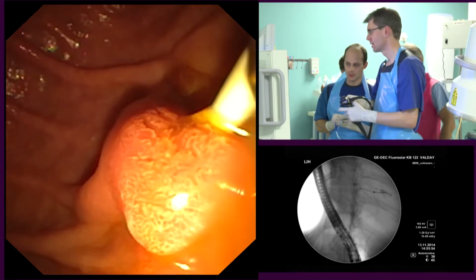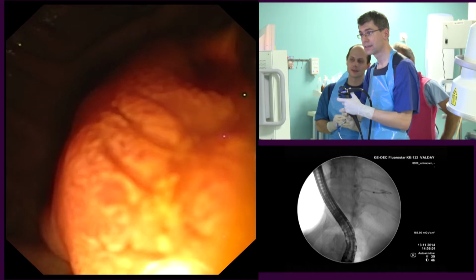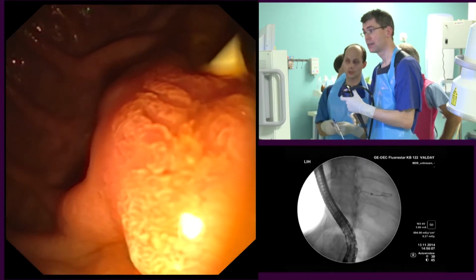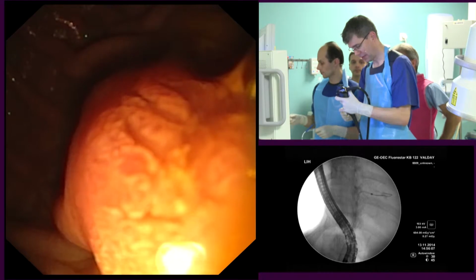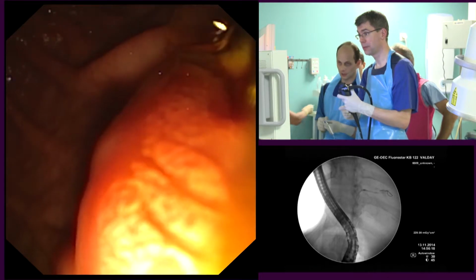And what is it right now? Let's see. Still moving. Strange. Okay, could we remove it and try to inflate outside? Sure. Just to see. But please push the balloon. Push the wire, I mean.